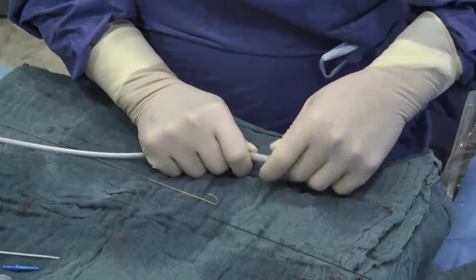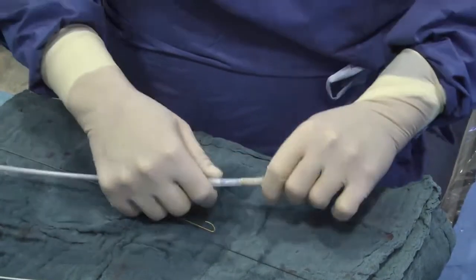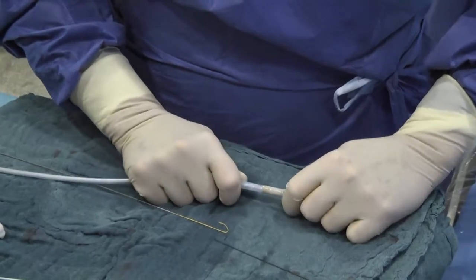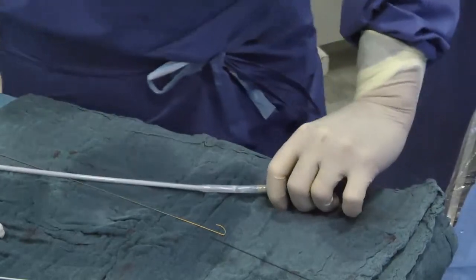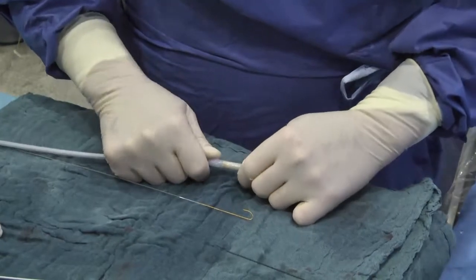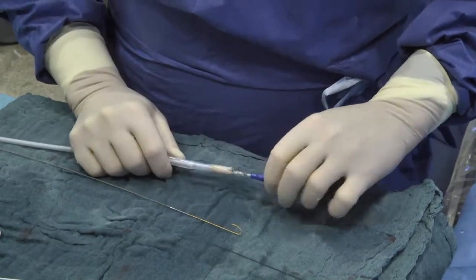Because they're suggesting that the Melody has a thickness of 0.0 millimeters. If you see this, you know that's stupid. And so when you speak about a Sapien 26, it means that the Sapien 26 is 26 millimeters outer diameter. When we speak about a 22 millimeter Melody, we mean inner diameter, and the outer is then larger. The valve is sliding a little bit.